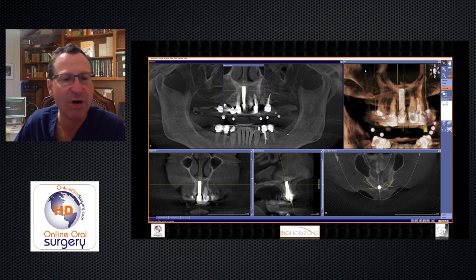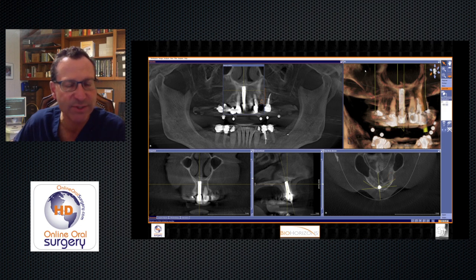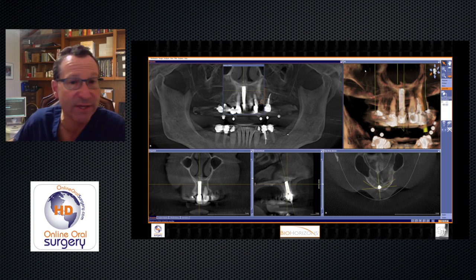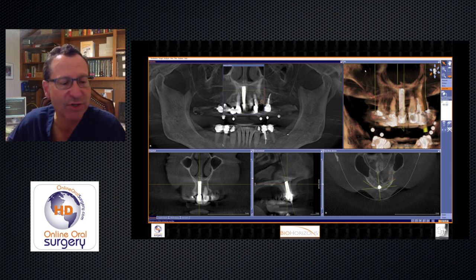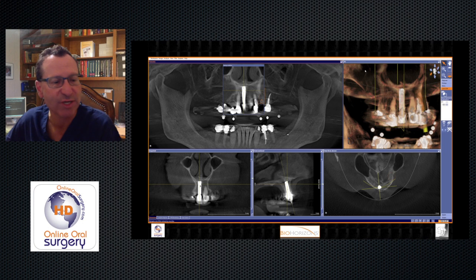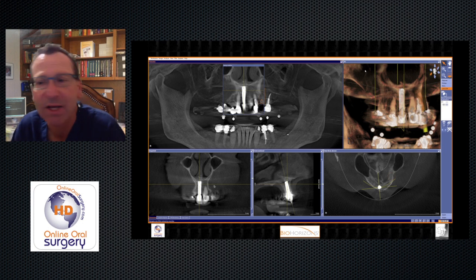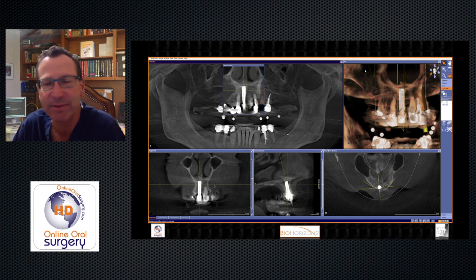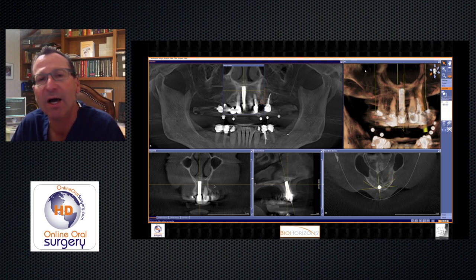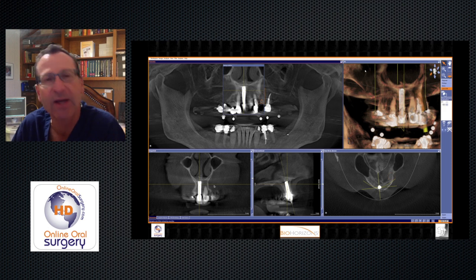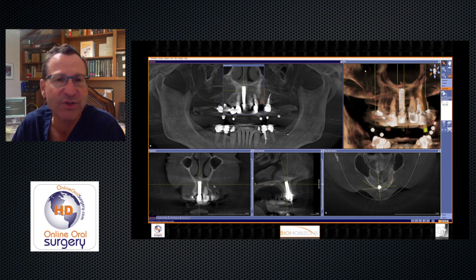Here is the post-op image from that patient after implant placement. You can see the implant placement was spot-on perfect — right in the middle of the ridge bucco-lingually, right where we needed to be. This patient has an immediate provisional restoration, the final abutment was placed at surgery, we're in good solid bone parallel to the adjacent teeth. This is ideal implant placement done very simply, taking about three minutes, through a tissue punch technique because there was lots of nice keratinized tissue. The provisional restoration went on with almost no adjustment.